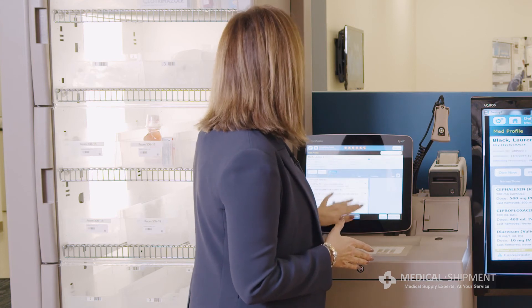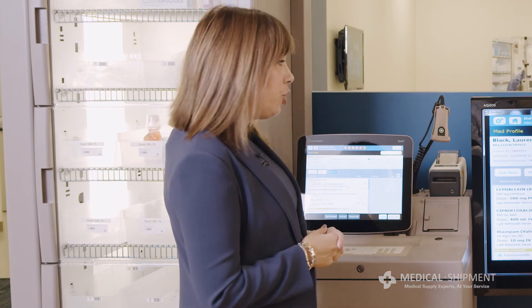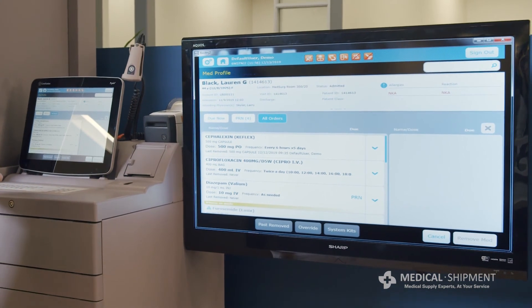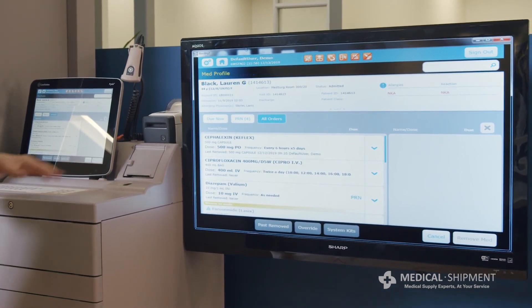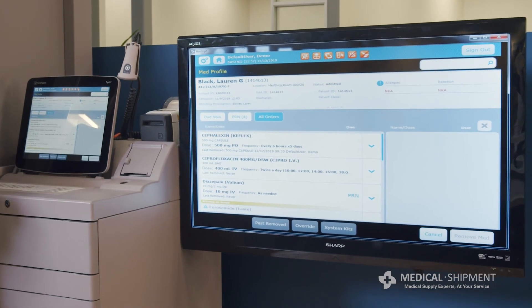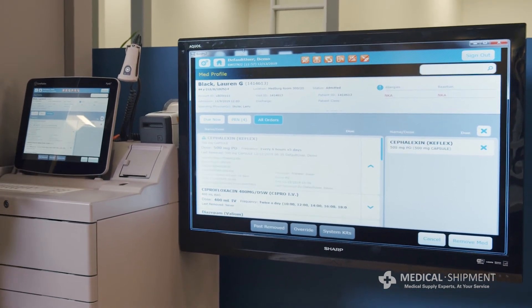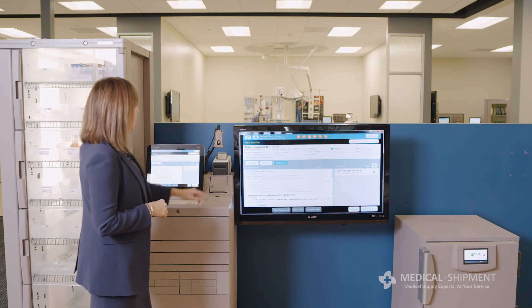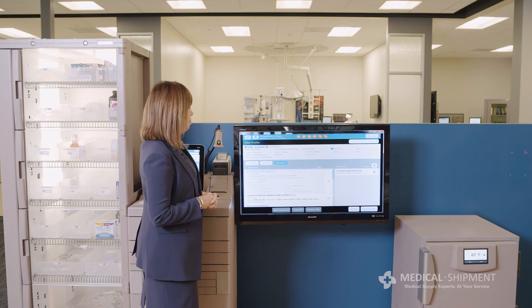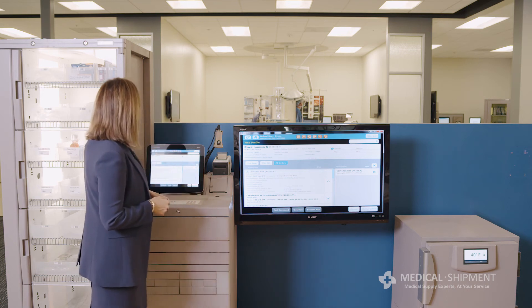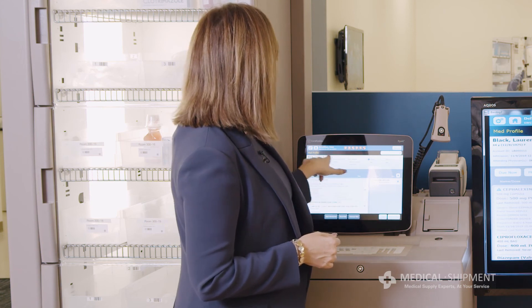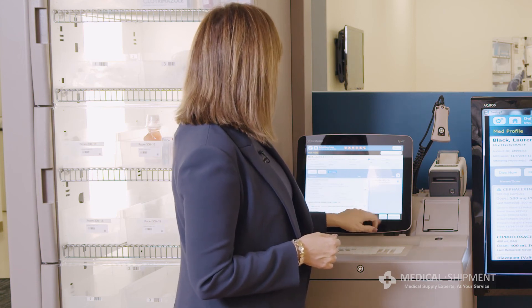There are chevrons that allow me to look at additional information on Lauren, such as her age, her admission date, her attending physician, and if she has any known drug allergies. I'm going to select Keflex for Lauren, and I also have a chevron indicator here that allows me to look at relevant information around that medication in further detail if warranted. There is Keflex now selected on the right-hand side of the screen that I'm going to remove for patient Lauren Black.